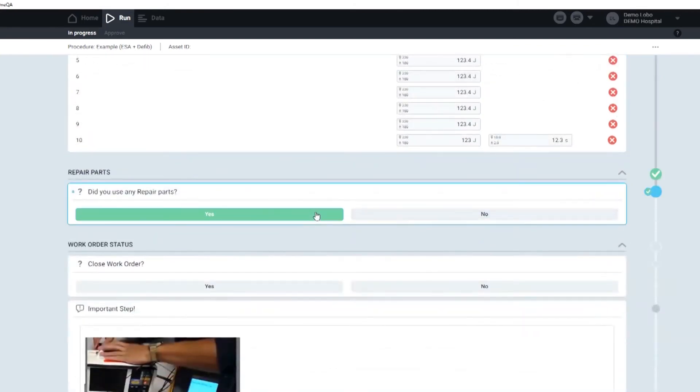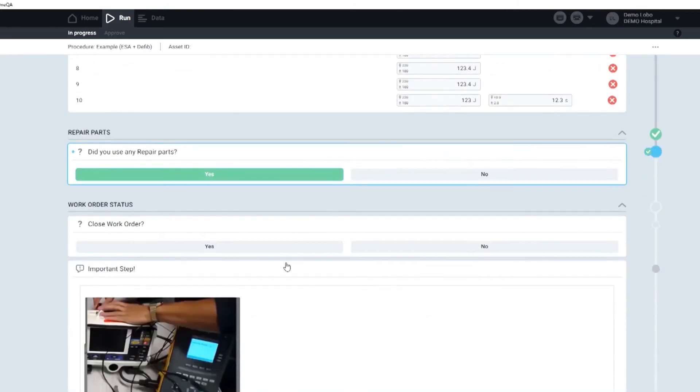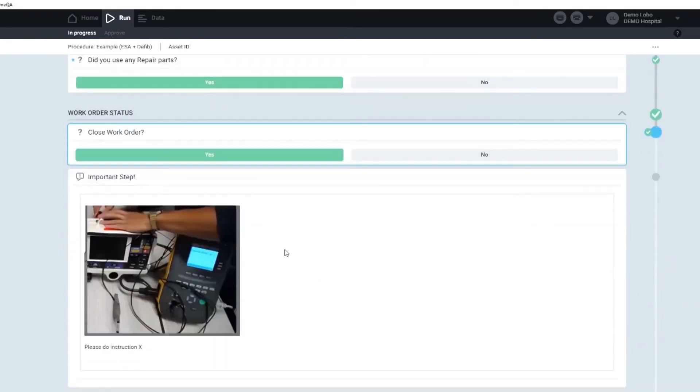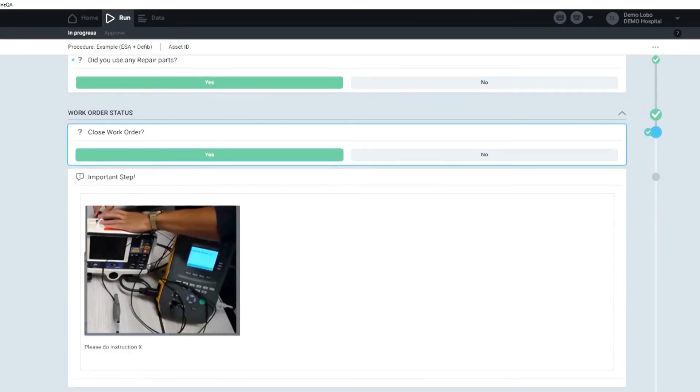Now, I just select yes here. I did use repair parts, and I also want to close that work order. So now there's the last important step, and all I have to do is press done.